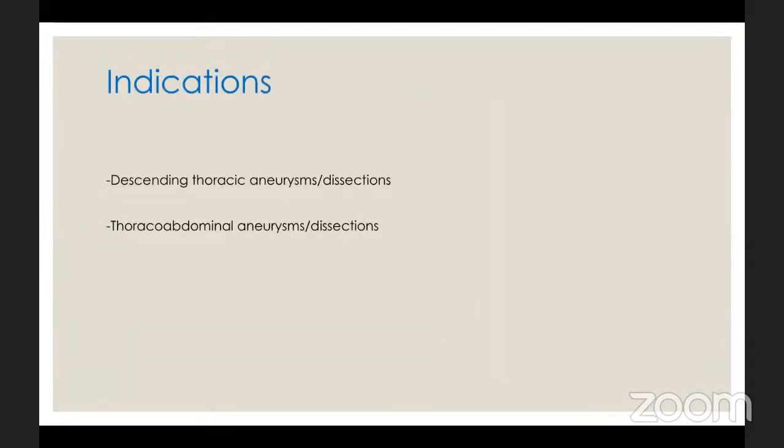So the indications of left heart bypass: we use it in descending thoracic aneurysm and dissection, and in cases of thoracoabdominal aneurysm and dissection.